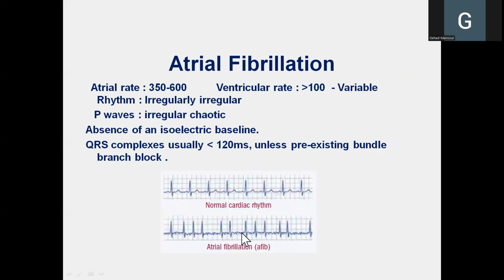So you have small waves of depolarization that do not sum up together and that do not form the regular P wave. So in order to find the regular positive small upright P wave that we see in a normal ECG tracing, we should have the waves of depolarization all arising from the sinoatrial node and at the same time so that they can sum up.